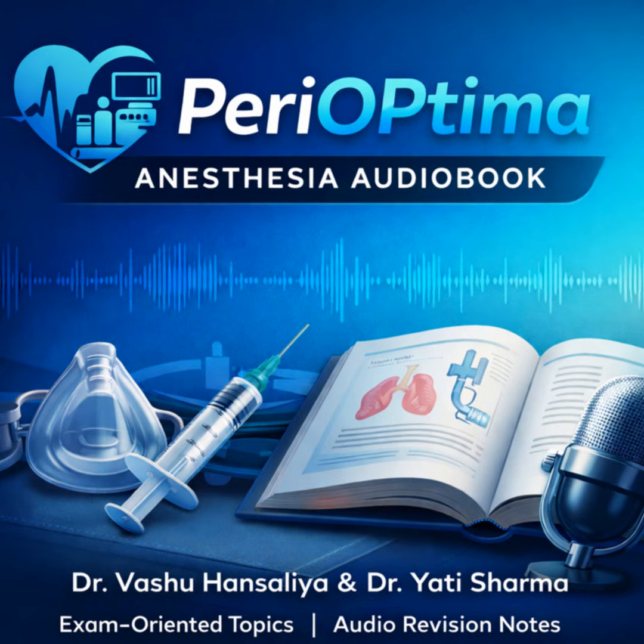We also have that specific hardware-related trap. Yes, the Desflurane altitude trap. The Tech 6 Plus, for all its sophistication, requires manual input at high elevations, because it maintains concentration, but it can't sense the drop in ambient pressure. Exactly, so it can't maintain partial pressure equivalence. This is a known, engineered limitation that relies entirely on the human to prevent a dose reduction. If the clinician fails to make that pre-op altitude adjustment, the patient will get a subtherapeutic dose, risking awareness or inadequate depth of anesthesia. It's a classic example of where human error can creep in despite safety mechanisms.